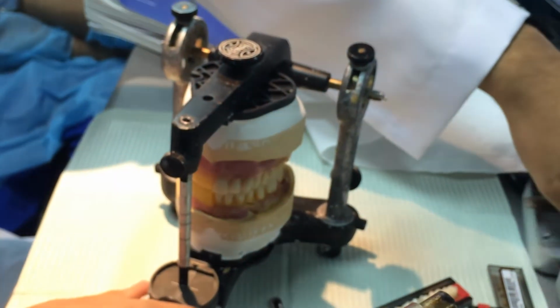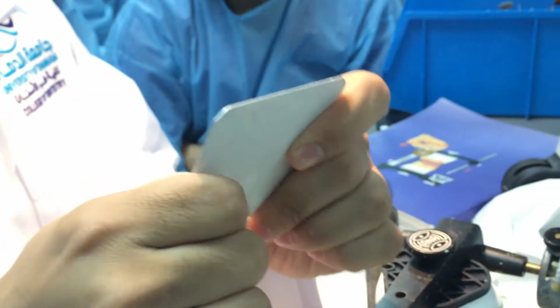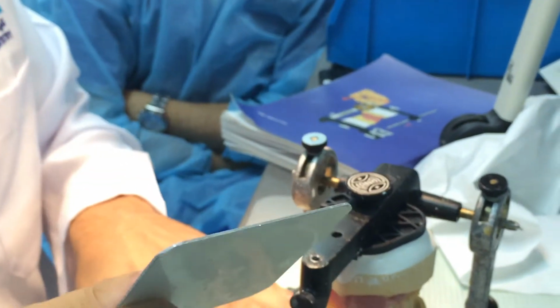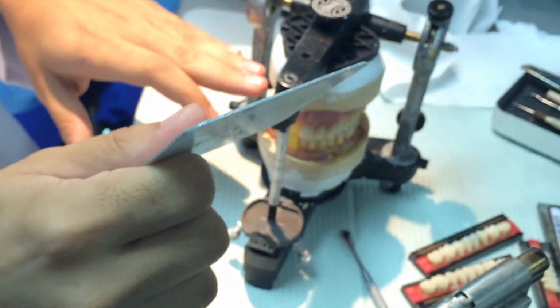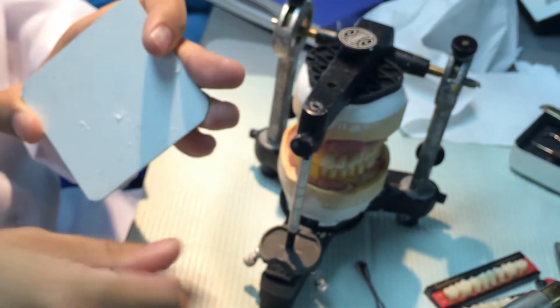We can use a flat surface like this, right? This is what the doctor told you. Yeah, so this is going to help you also. But if you are sure of your wax rim, the wax block is going to give you the same advantage. Okay.